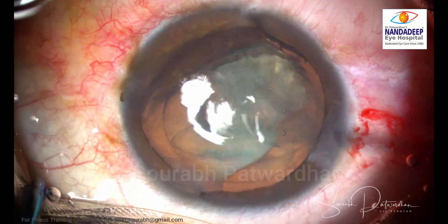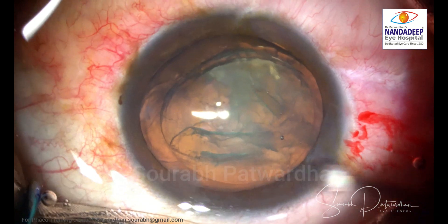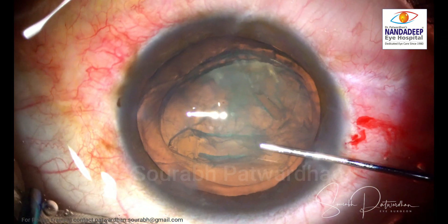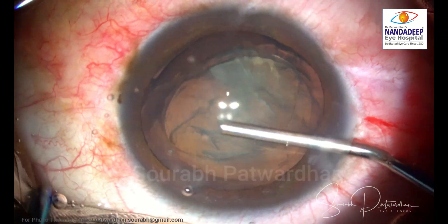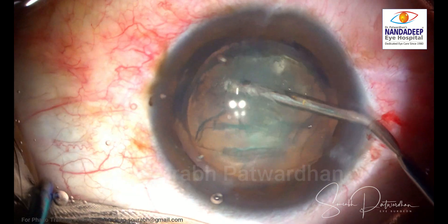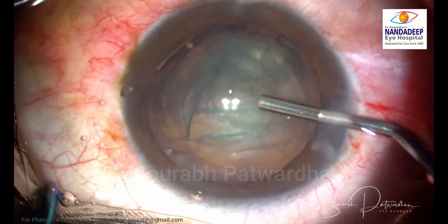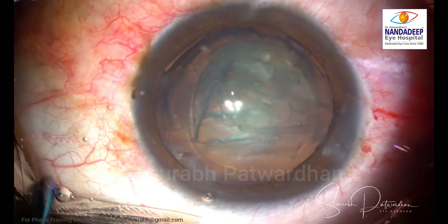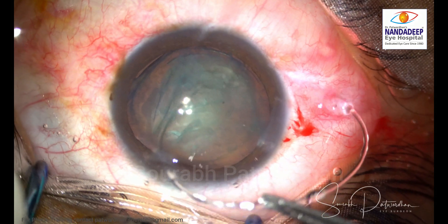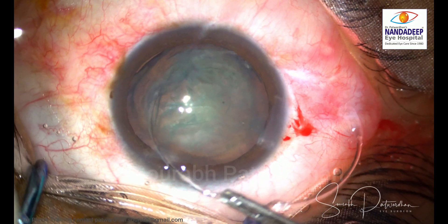Sometimes it might be difficult to remove the nucleus and the bag may be damaged, though here the subluxation is in a very small area — less than three clock hours.